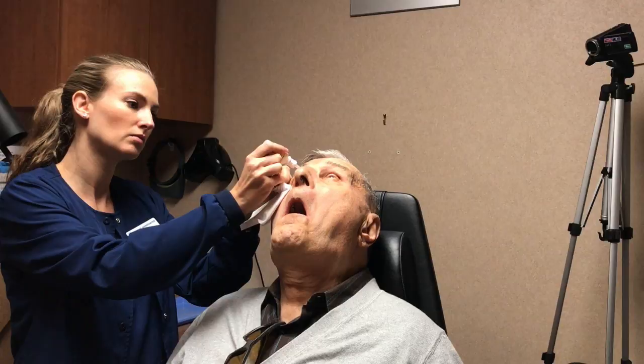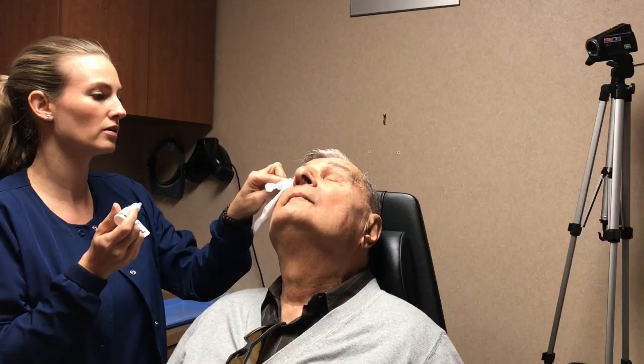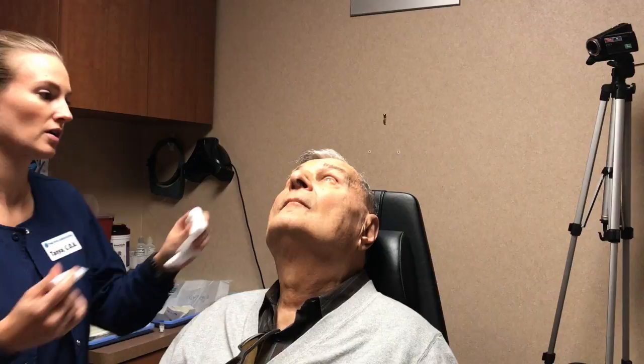Good. And then I'm going to do another one here — this is more like a gel numbing drop, so it's a little thicker. Go ahead and close your eye and just rest it. I'm going to go get your medication and get it set up, I'll be right back.